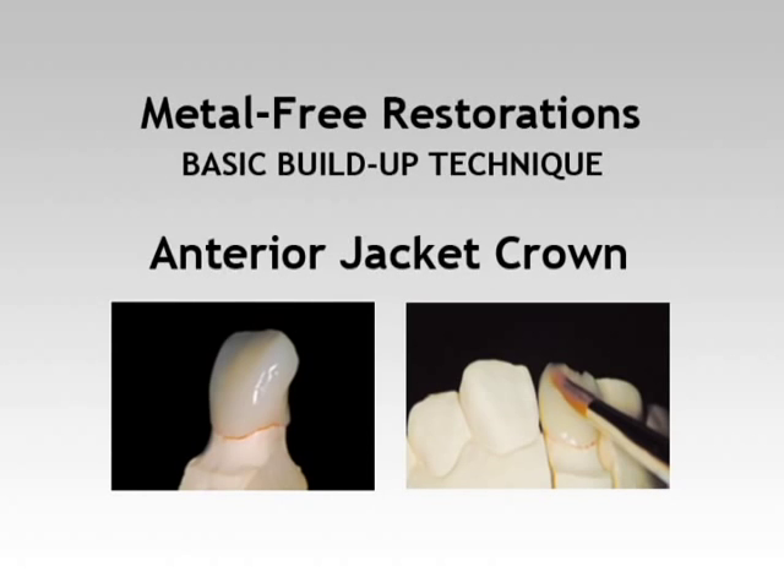We will guide you through a fast and easy fabrication technique to achieve porcelain-like aesthetics for a metal-free single crown using the Ceramage Micro Ceramic System.